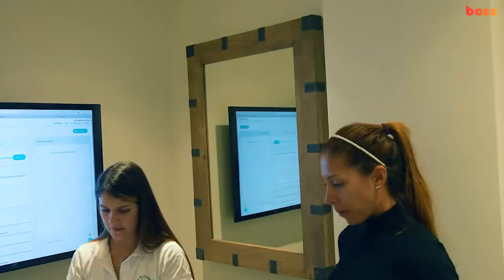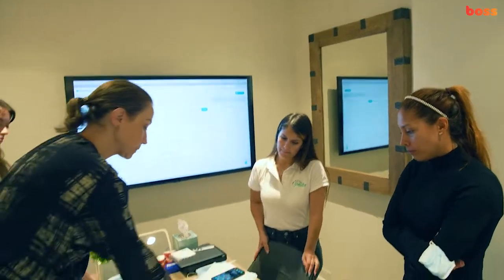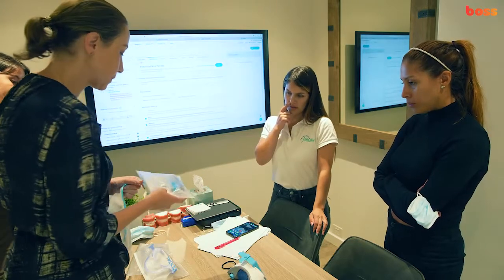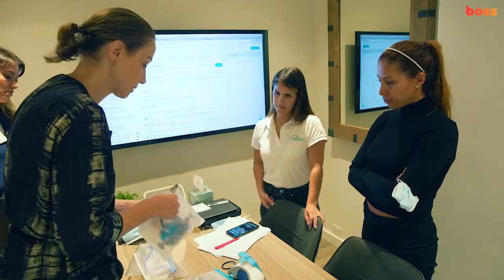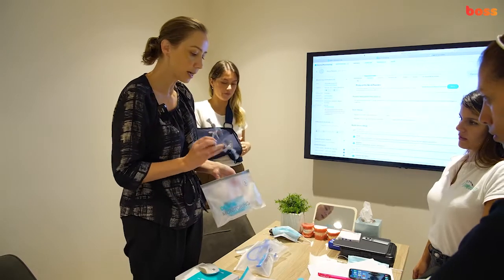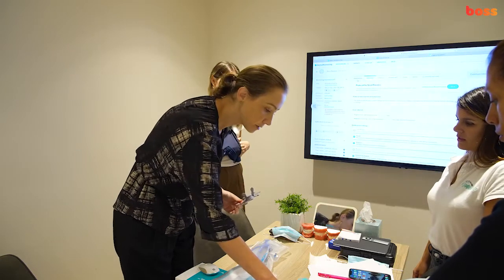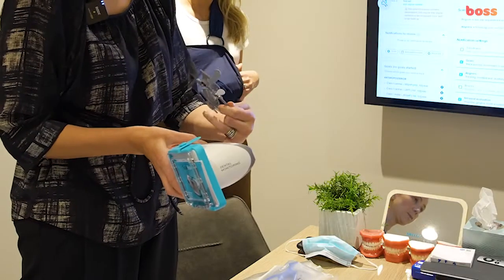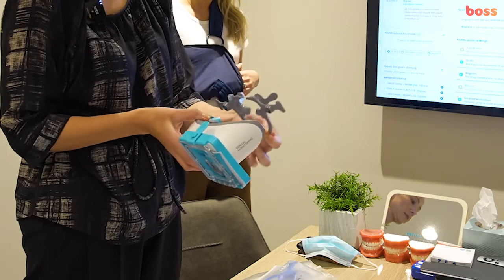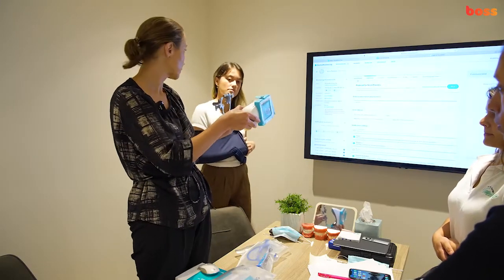Let me run through the difference between the trick retractors. You've got some that are blue and some that are gray. The gray trick retractors are used with this particular scan box. When you open it — that's a small size and that's a medium size — you can see the retractor has these metal bits, which are magnets. These magnets connect and click in like that. That's why you give them the gray trick retractors along with the scan box.